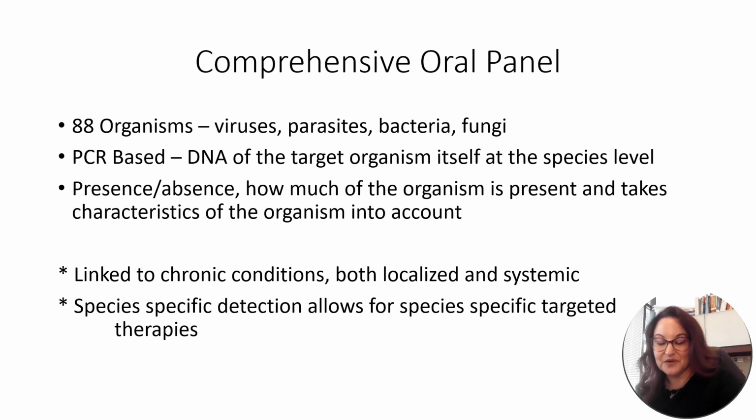The comprehensive oral panel is a very large PCR-based panel that is composed of 88 organisms, primarily bacteria, but inclusive of bacteria, viruses, parasites, and fungi. We utilize PCR to target the DNA of the causative organisms themselves.